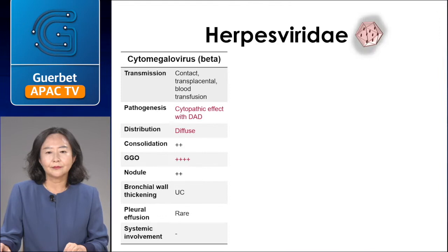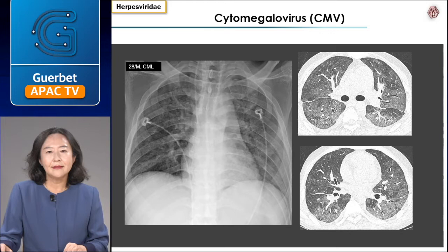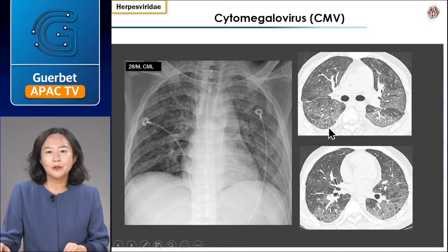Another important virus in immune-compromised hosts is cytomegalovirus. CMV shows diffuse ground-glass opacity with nodules on CT scan. The differential diagnosis includes Pneumocystis jirovecii pneumonia or pulmonary edema. This is a 28-year-old male with underlying CML presenting with shortness of breath and dyspnea. Diffuse ground-glass opacity is shown on CT scan. CMV pneumonia is a life-threatening pulmonary infection in immune-compromised hosts, especially AIDS patients, with cytopathic effects causing severe pneumonia with diffuse alveolar damage.